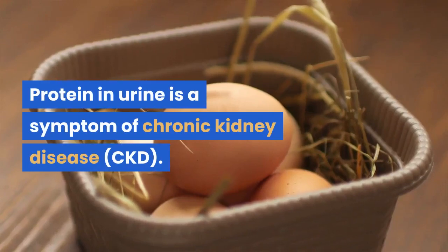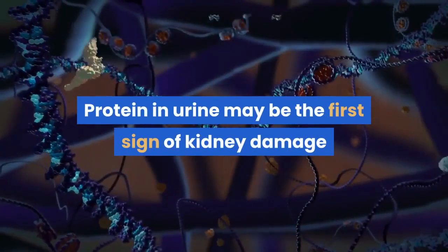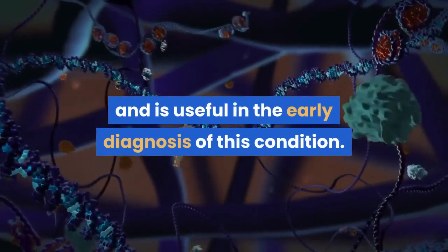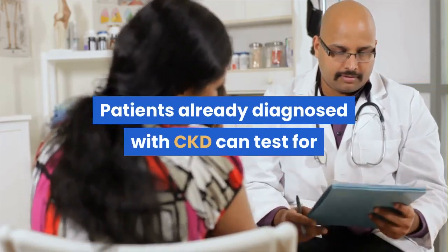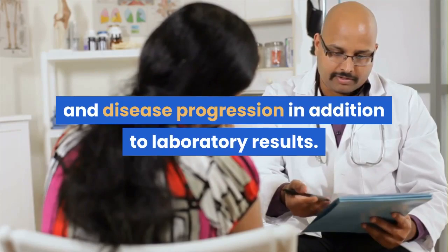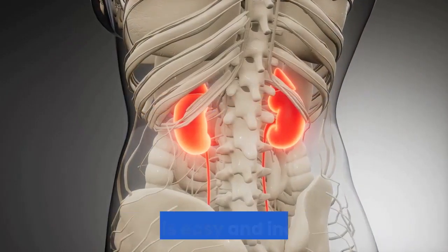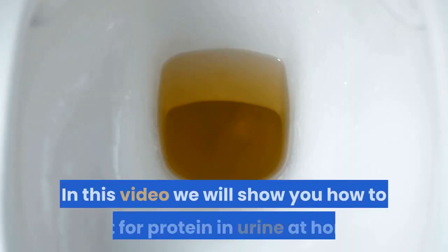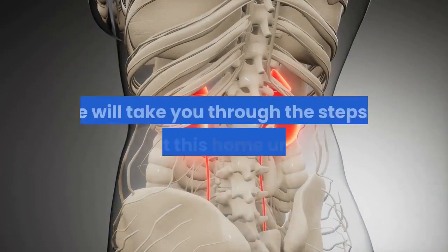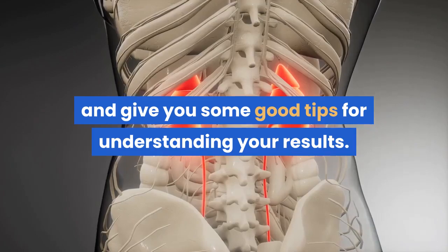Protein in urine may be the first sign of kidney damage and is useful in the early diagnosis of this condition. Patients already diagnosed with CKD can test for protein in urine at home to monitor their treatment and disease progression in addition to laboratory results. If you want to test at home it is easy and inexpensive — we will show you how, taking you through the steps and giving you tips for understanding your results.